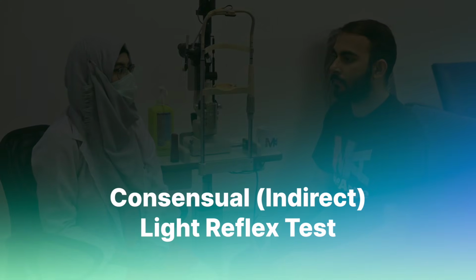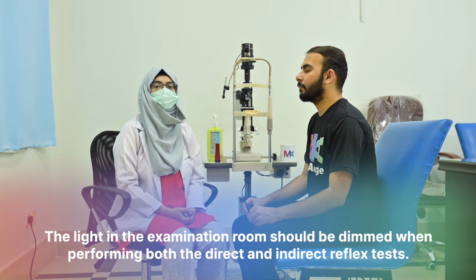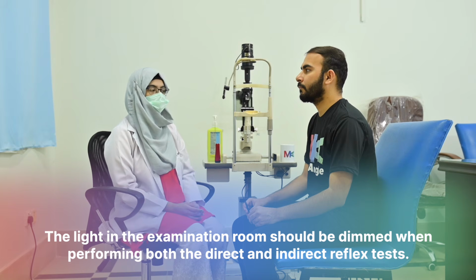Next test is indirect light reflex test, that is consensual light reflex test. For that purpose, you have to ask the patient to look far away. And one more thing, in both of these tests, the light should be dim. The room should be dimly illuminated.